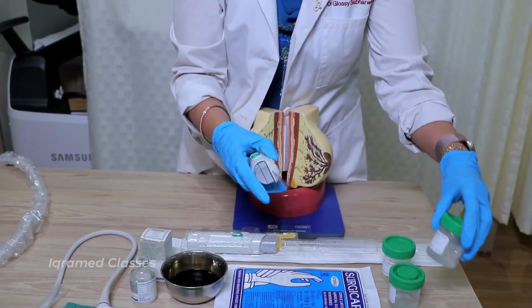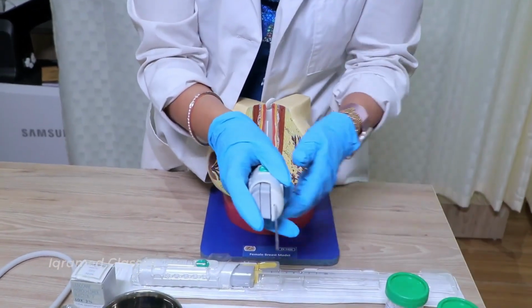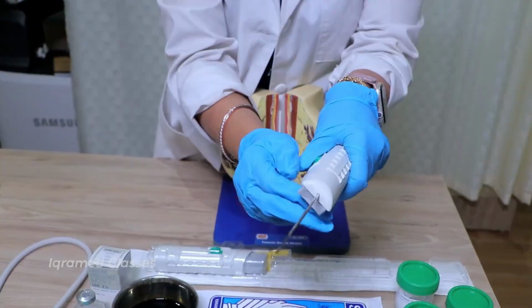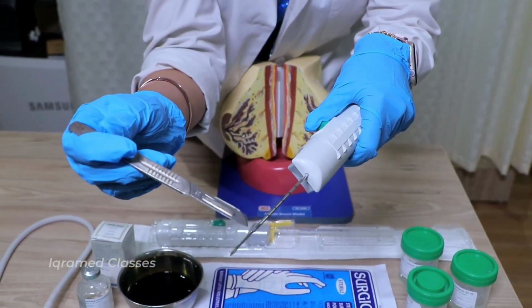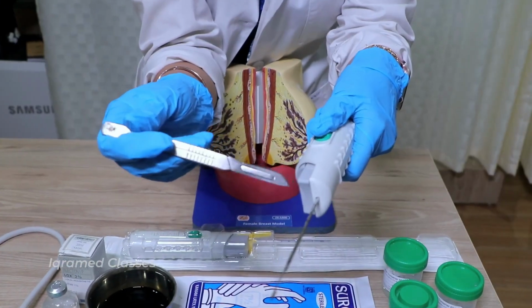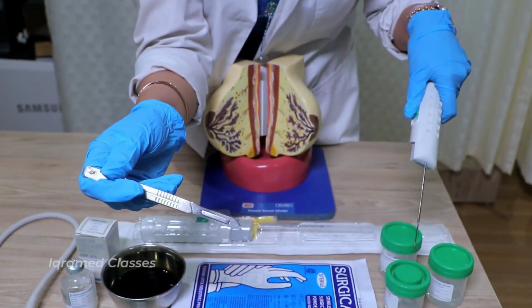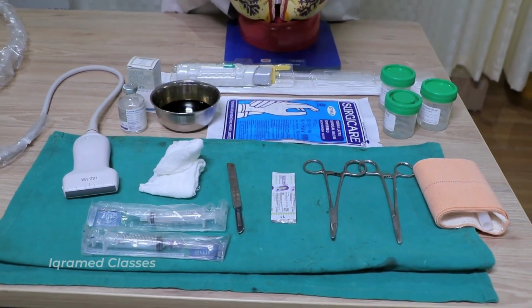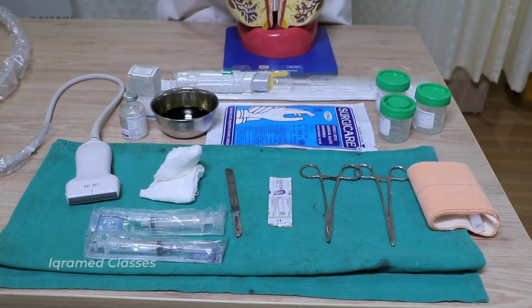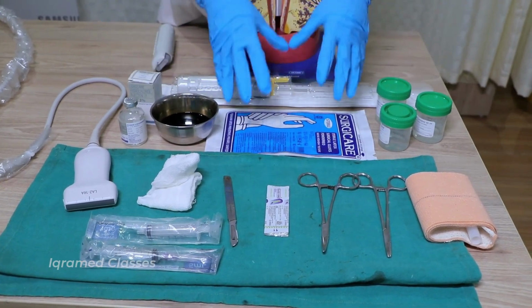Then the sample, which can go in diluted formalin, you will open that bottle and you will carefully see that there is a blade here. Carefully look at this. You will pull one of the knobs back and the tissue will come here, which you will put in the formalin. And if you want another sample, then you will again take from the other site. So that is the basic setup that we have.